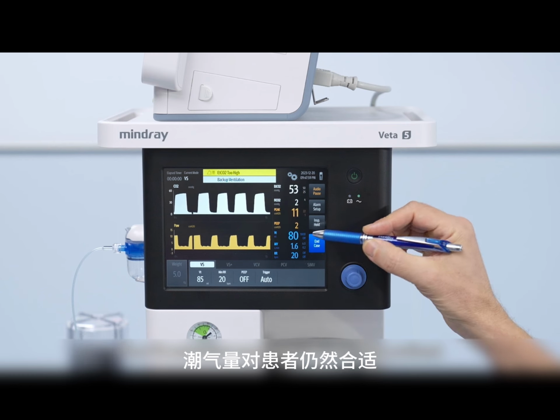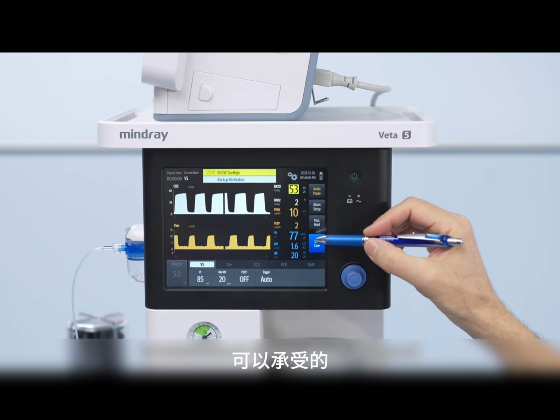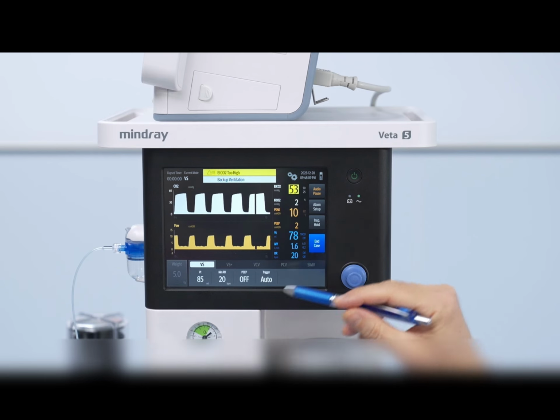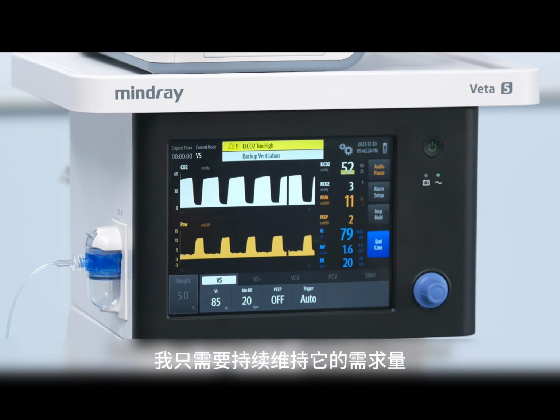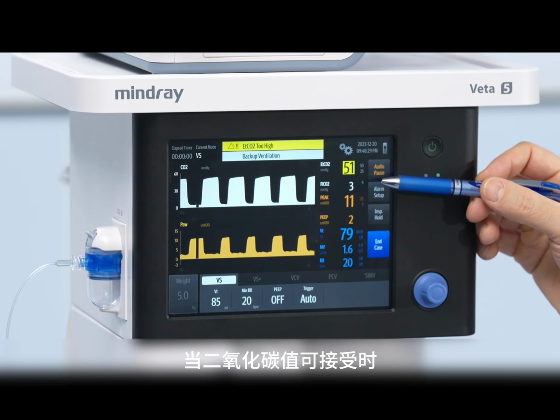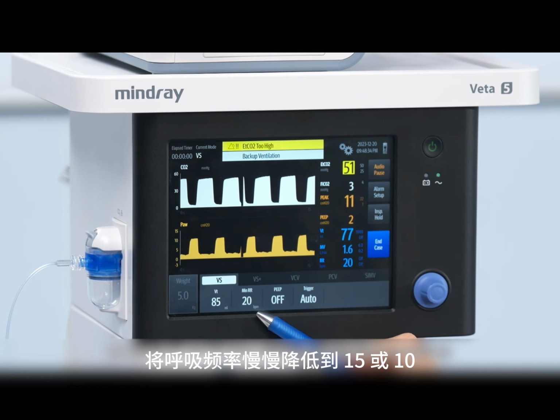The tidal volume remains appropriate for the patient, and the peak inspiratory pressure is tolerable. So these values are good. The respiratory rate that we got is in fact 20, and there is no spontaneous breathing. The CO2 is coming down. We just need to give it some time. So I would just continue it as long as it's needed, and when the CO2 is acceptable, then I would slowly decrease the respiratory rate towards 15 or maybe 10 as the clinical situation requires.